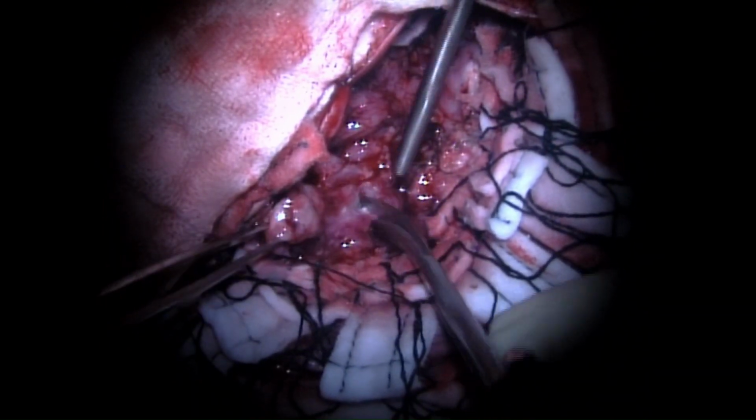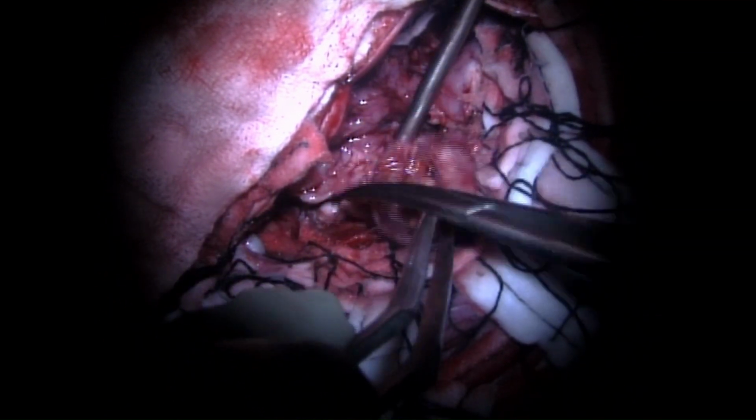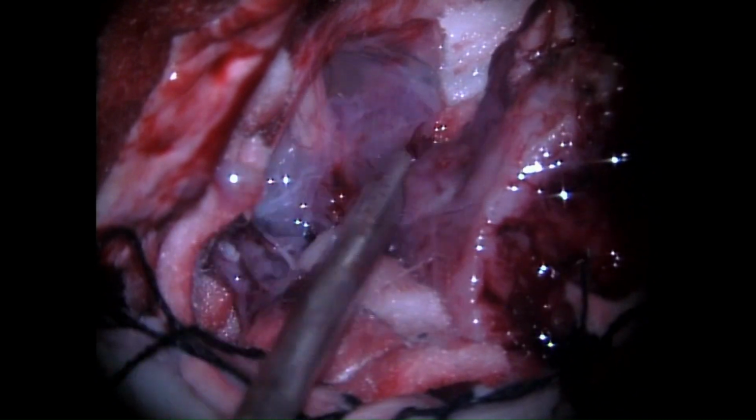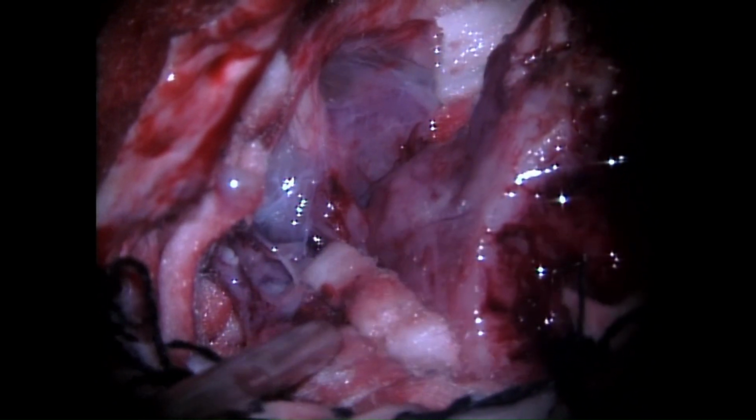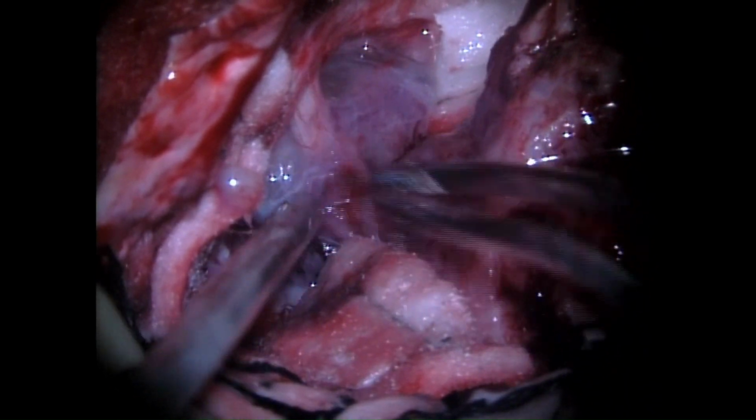In this case, this tumor was quite large, as you can imagine and see for yourself, that just kept on coming to the surgical field. The more we removed, the more kept coming.